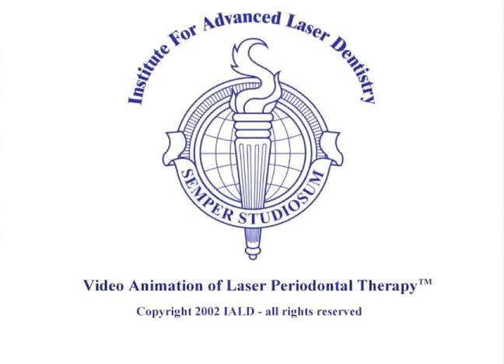This is the video animation of the FDA-cleared laser periodontal procedure called Laser Assisted New Attachment Procedure, or LENAP.